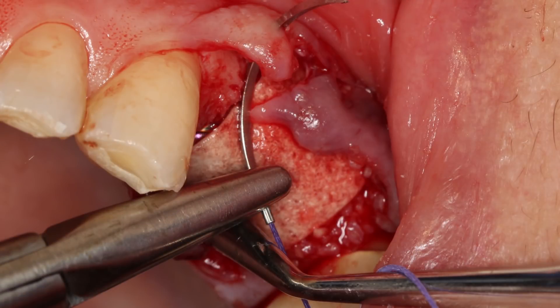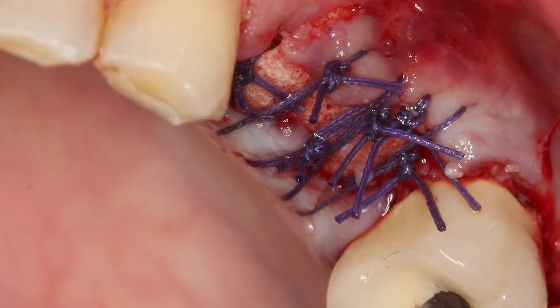Suturing a membrane graft can be challenging. The cutting needle sometimes grabs onto the membrane and dislodges it. I have found the technique of taking the needle from the crestal to the facial and then reversing the needle and engaging tissue from the crestal to the palatal to be most efficient. A reverse bevel helps avoid catching the membrane as the surgical site was sutured.